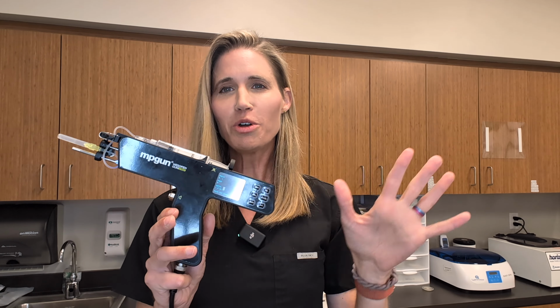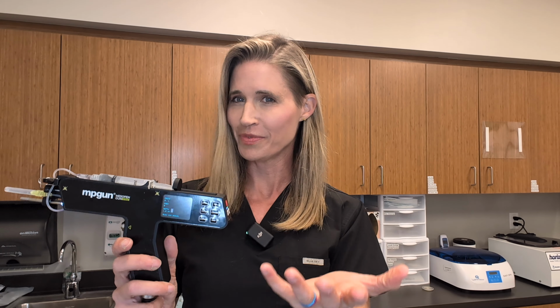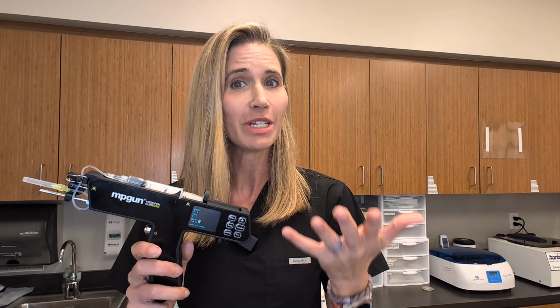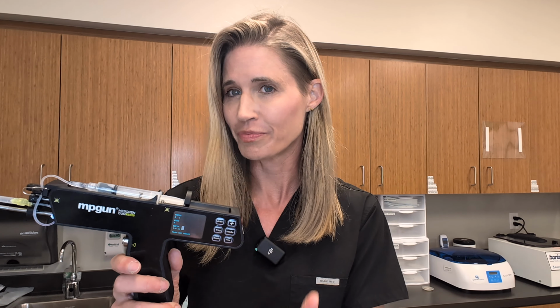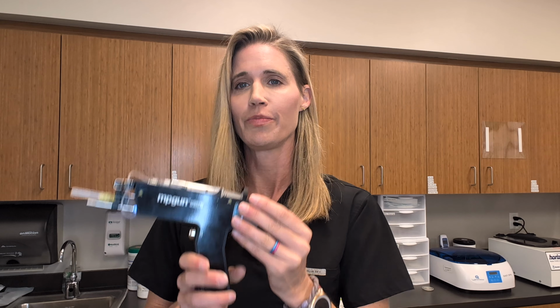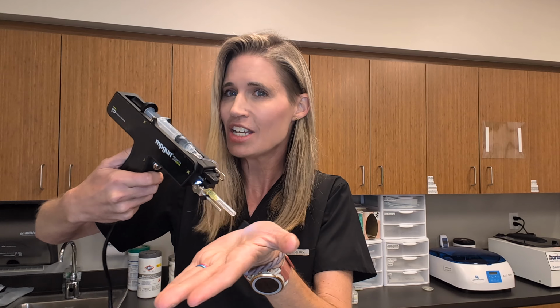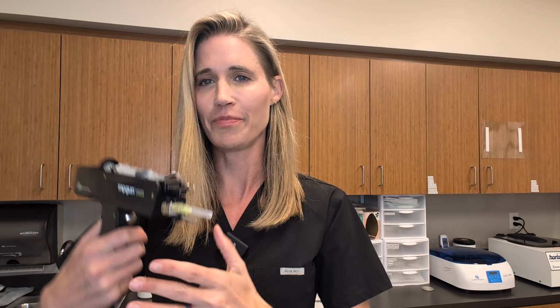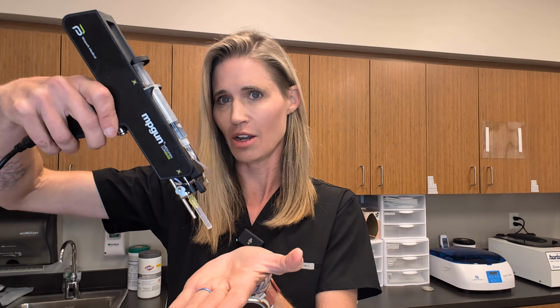All right, so some general rules. If you're using a deeper depth, you want to use a slower frequency. If you want a higher volume injected into each point, then you'll wish to use a lower frequency. Or you want to hold that trigger for longer. If you're using a higher frequency, you'll want to move more slowly across the skin to avoid scratching the skin. And you want to keep the device essentially perpendicular to the skin when you're injecting.